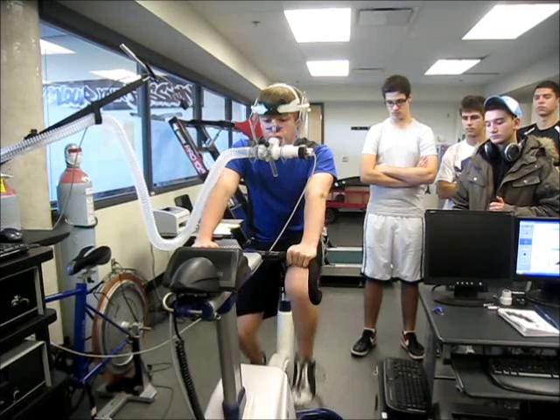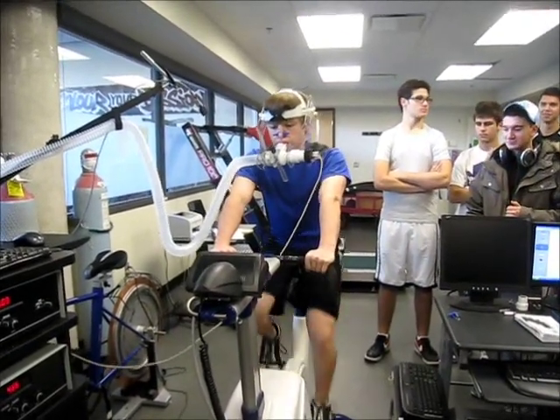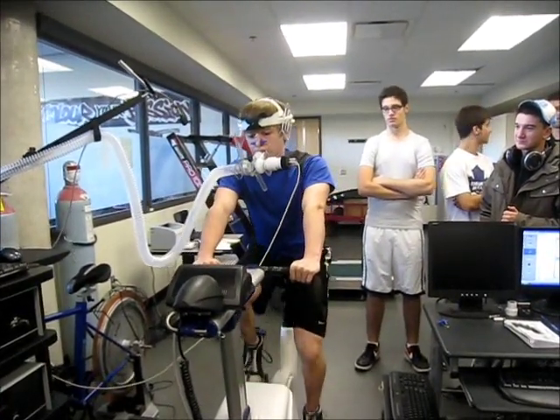These heart rate monitors are pretty expensive, but a lot of fitness enthusiasts like to have them so they can know what training zone they're in or what heart rate they're at. So it's a minute and 15 seconds in — still warming up. Go Daniel! It starts getting tougher.